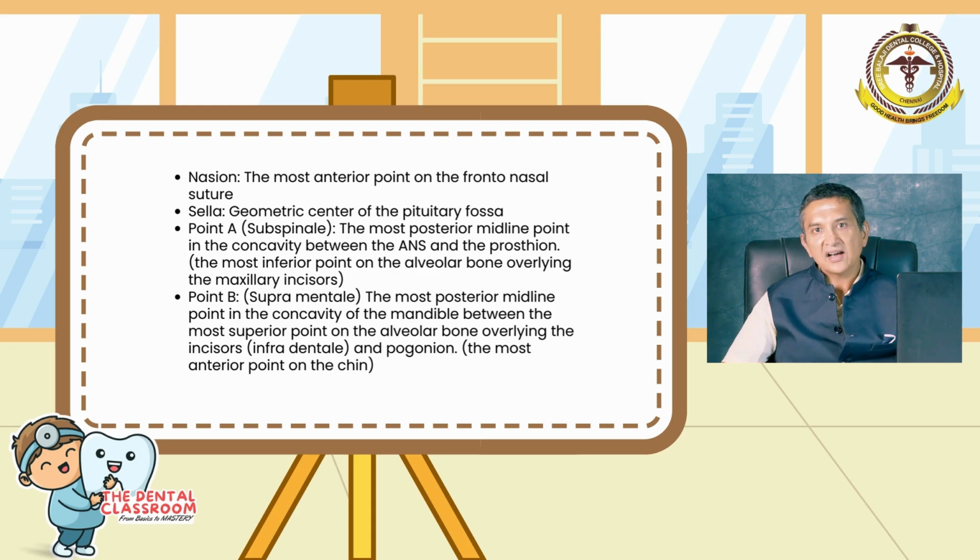These 2 points lie in the reference plane, or the cranial base, and are called reference points simply because after the age of 6 or 7, if you remember Scammon's growth curves and the cephalocaudal gradient of growth, these 2 points will not change over time, as the adult size is reached by the age of 6 or 7. So nasion and sella, in the upper third of the face, do not show great changes with growth after the age of 6, and as the name indicates, a reference plane is a plane which does not change.